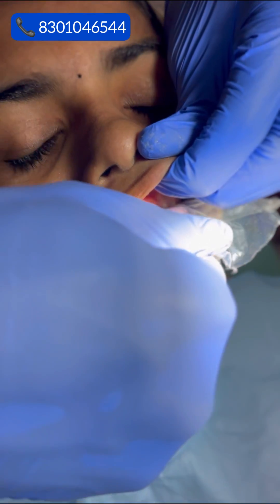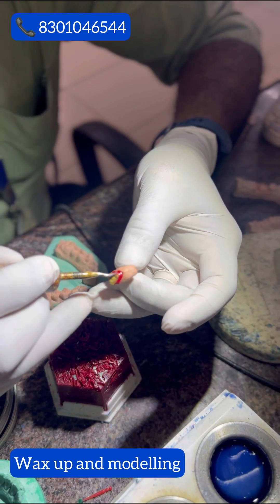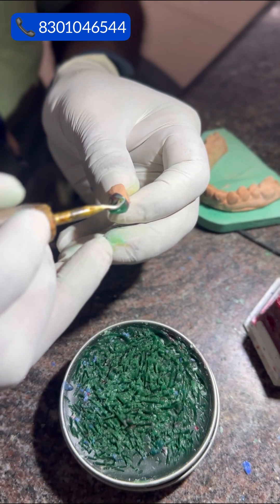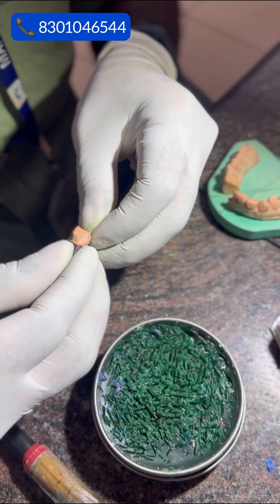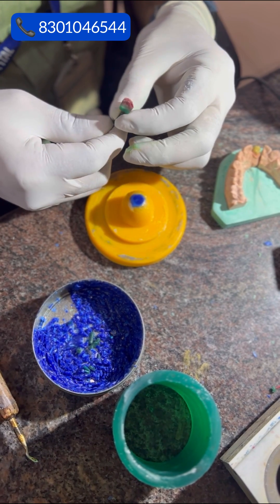Once we have the impression of the prepared tooth, a cast is poured and the skilled technician uses a special wax material to create a precise replica of the patient's tooth. This wax model serves as the foundation for the ceramic crown.